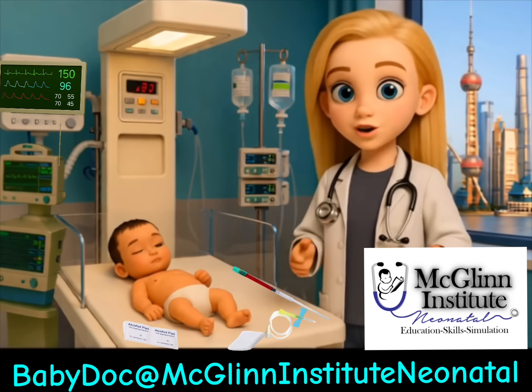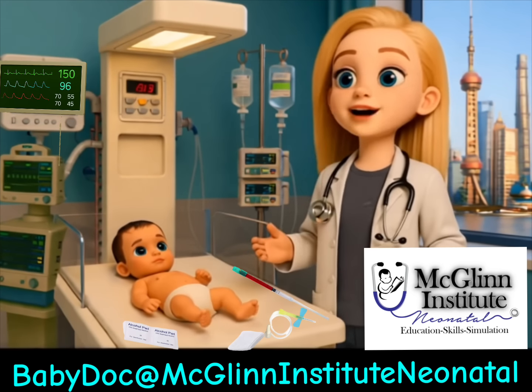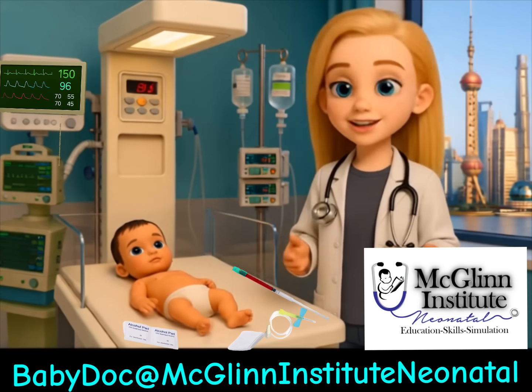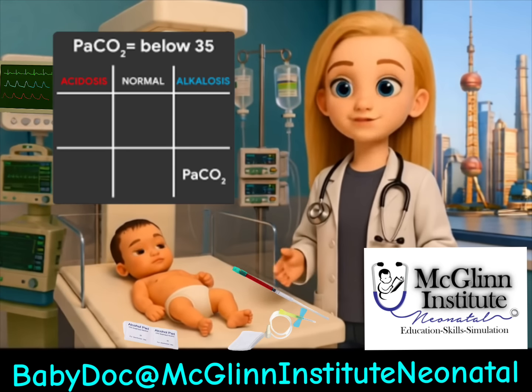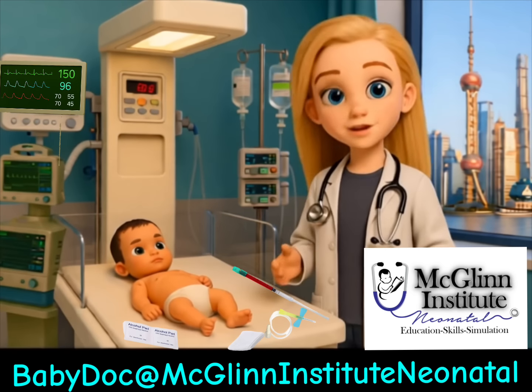This measures the partial pressure of carbon dioxide in the blood, which is controlled by the lungs. A PCO2 greater than 45 results in a drop in pH. This is known as respiratory acidosis, and some causes include inadequate ventilation due to respiratory sequelae such as RDS, pneumonia, or meconium aspiration. A PCO2 less than 35 results in an increase in pH known as respiratory alkalosis. Some causes include rapid breathing or mechanical hyperventilation.